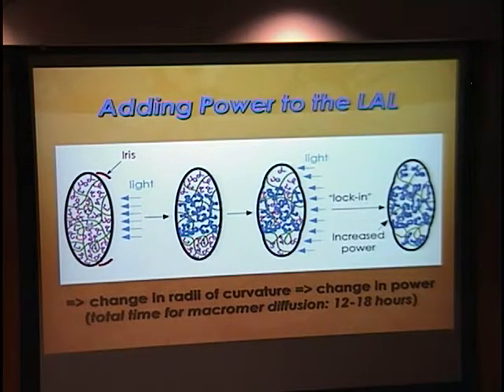So if you're going to get a patient to do this, they need to be very amenable to wearing light protection, because while it was originally a theoretical risk that ambient light could actually change this, there's a case report coming out of Europe where this patient didn't do as her doctor said, and her refraction just basically tanked within 2 weeks, and so they had to exchange the lens.